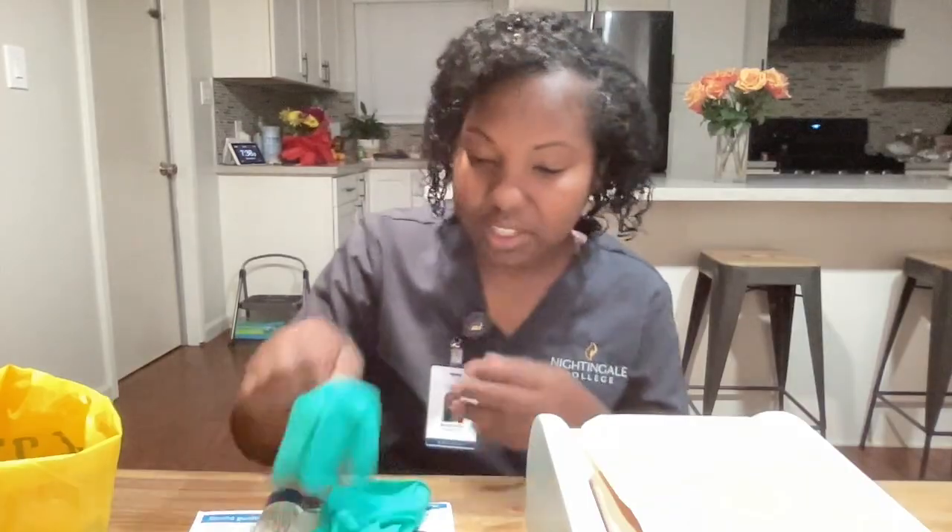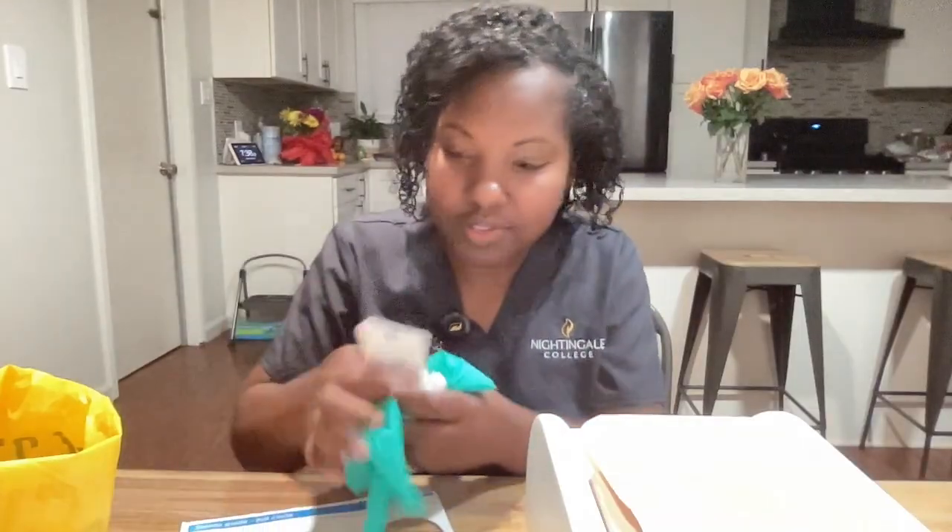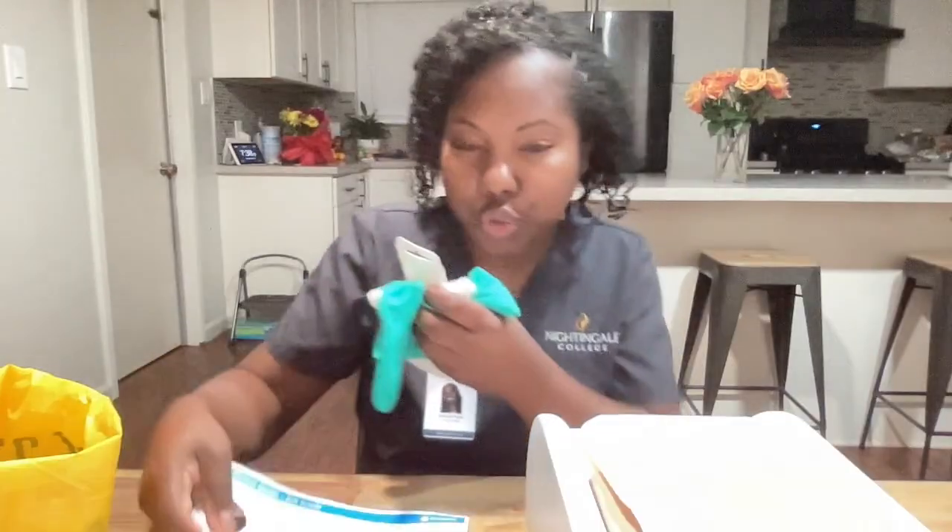Hello, my name is Michelle Nguyen. Today I will be demonstrating the colostomy care skill. The supplies that I'll be using: I have gloves, I have stoma paste, I have washcloths, I have my measuring tool, and I have my pre-cut base plate and pouch already applied to my patient. I will gather my supplies and proceed to my patient's room.